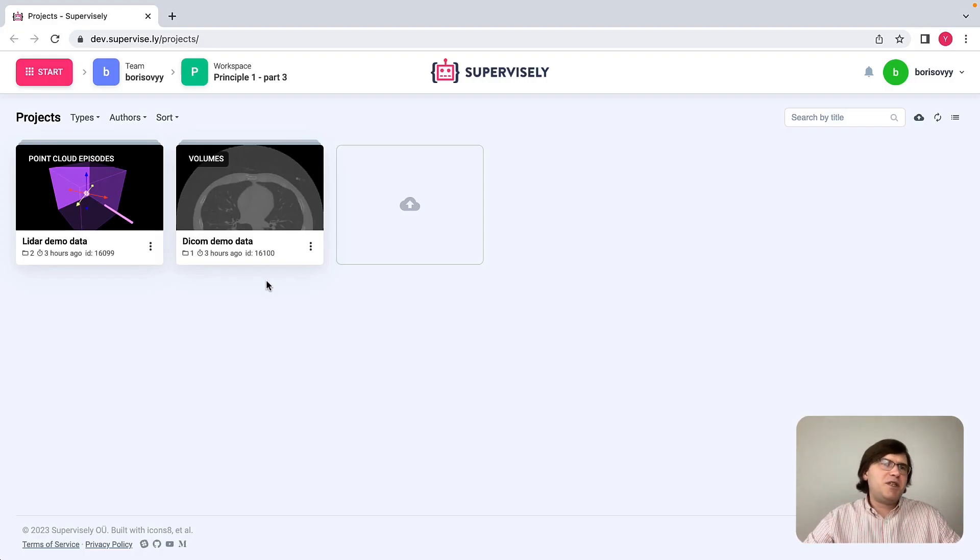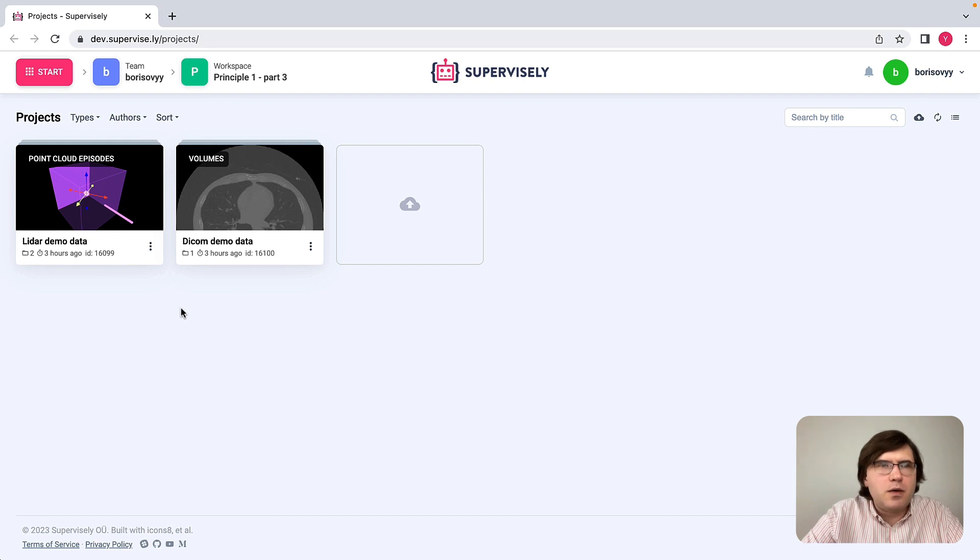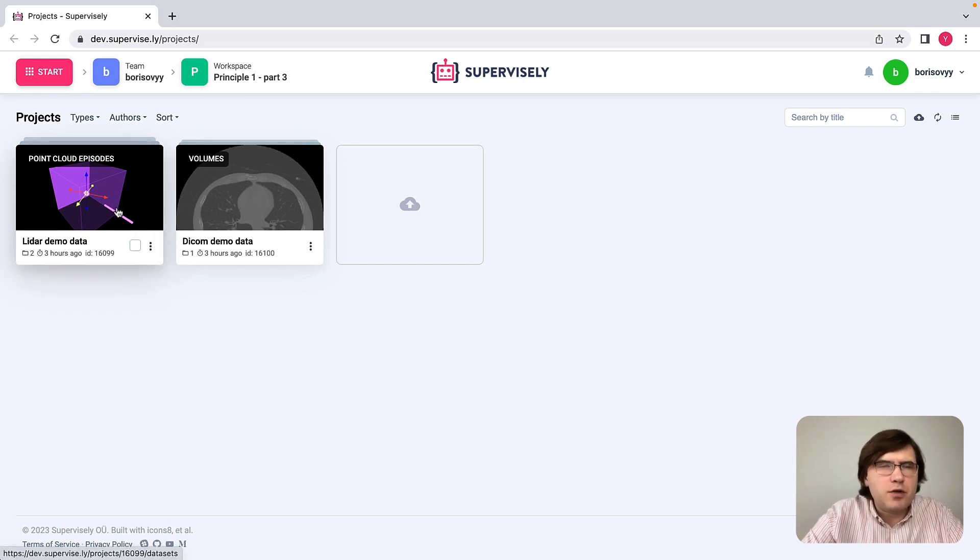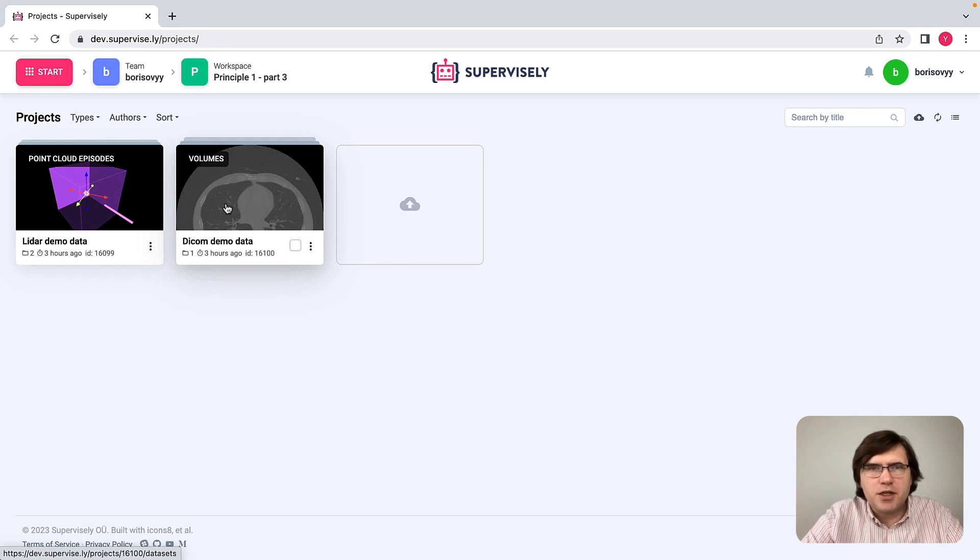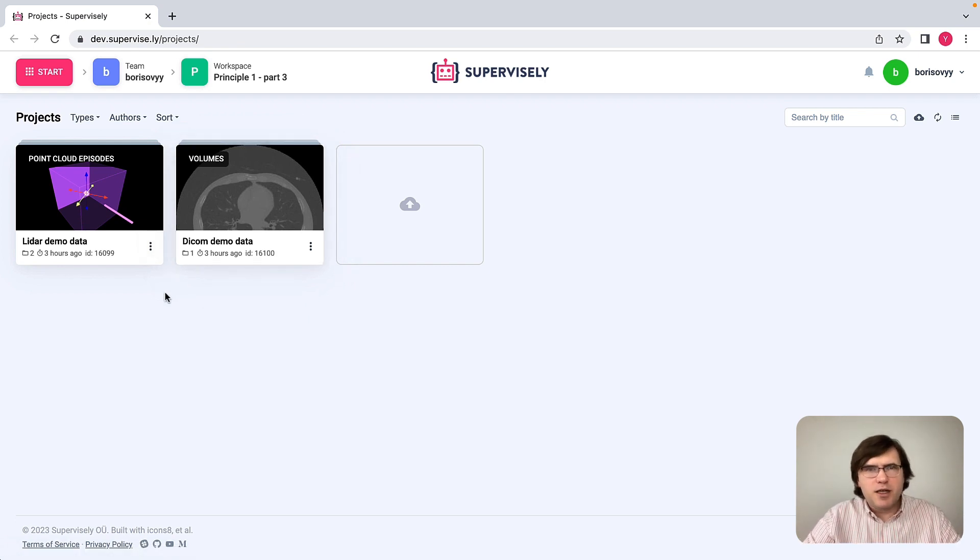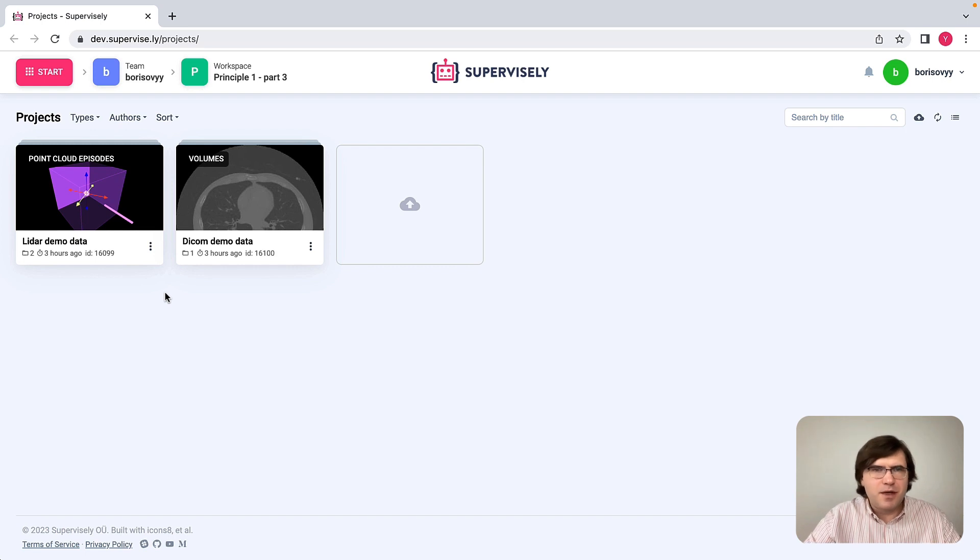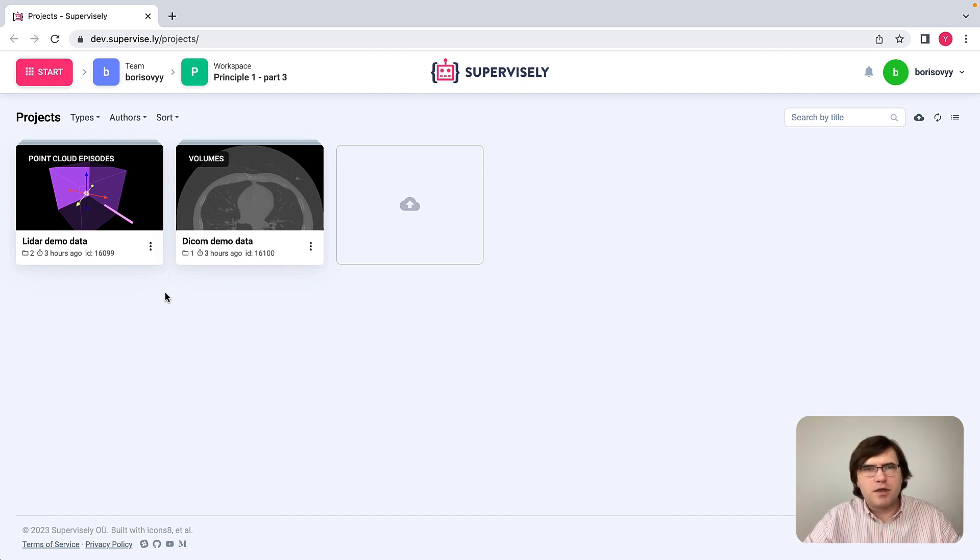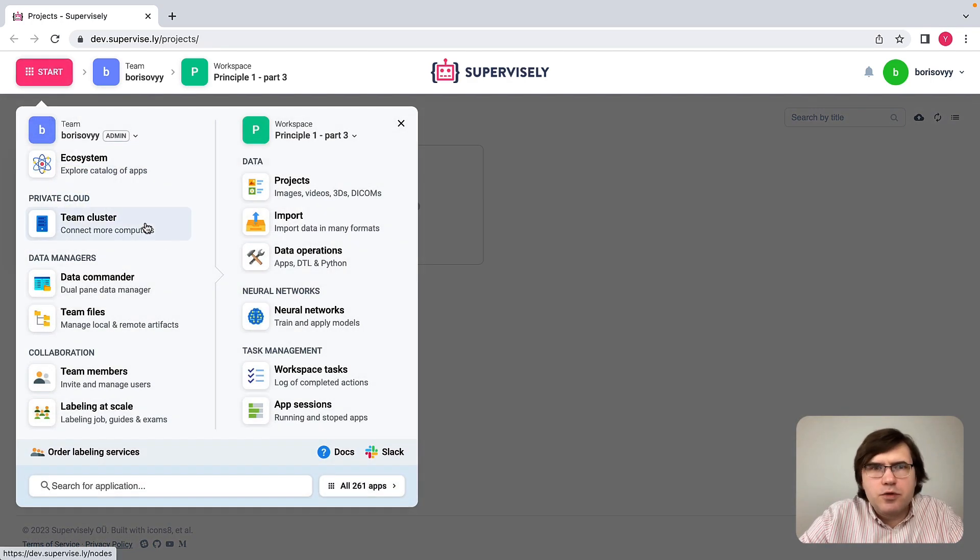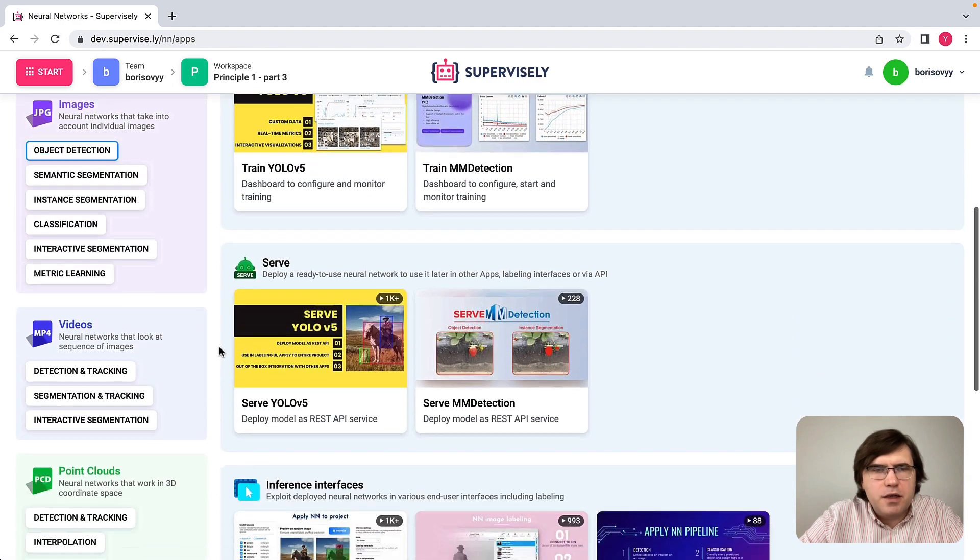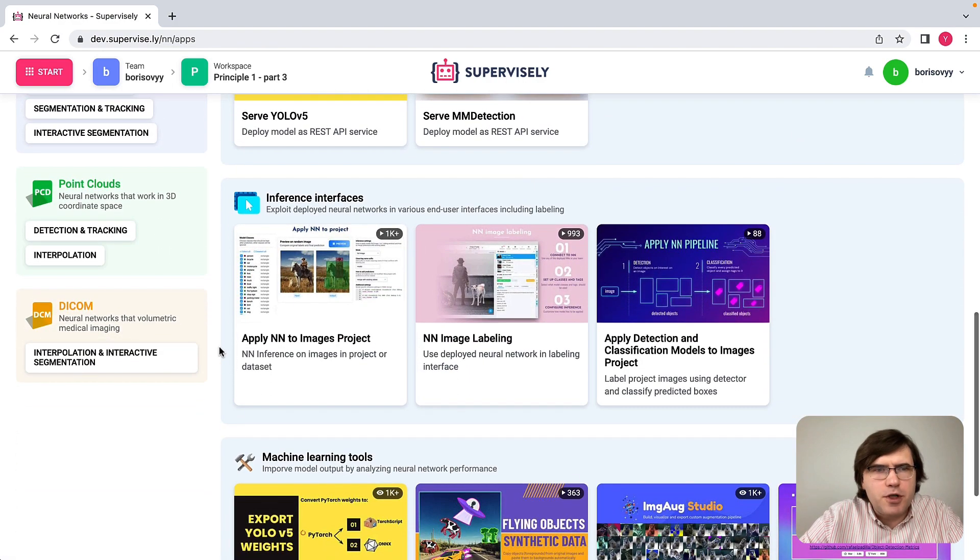In this demonstration, I will need two projects. The first project contains point cloud data, and the second project contains DICOM data. For me to demonstrate how we can leverage AI models in machine learning, I need to run several apps first. Let me do that. So I will go to the neural network section here, and let's start with DICOM first.